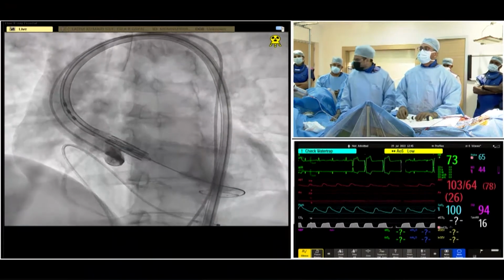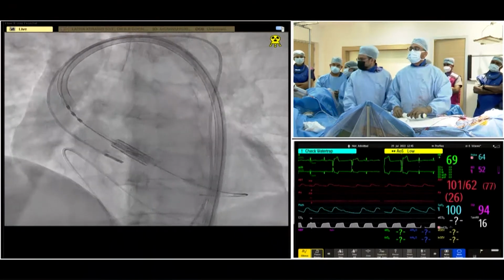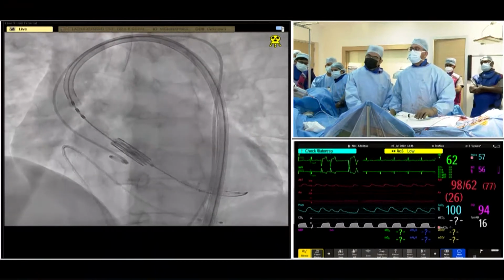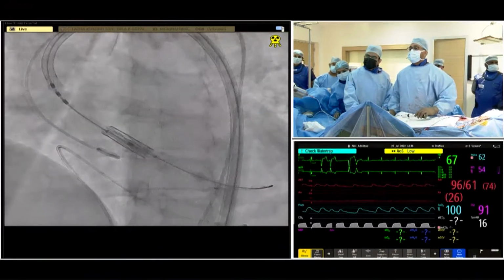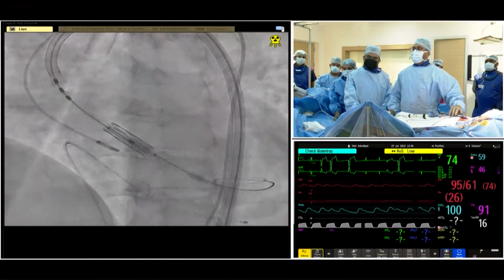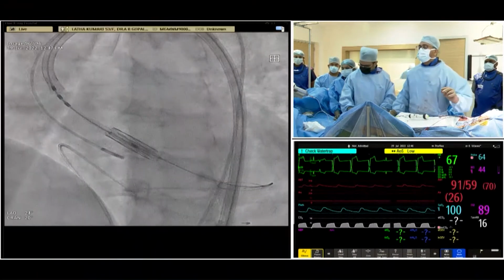Gopal, the earlier point that you had made about preserving future TAV in TAV options, I think that also makes balloon expandable a slightly better choice here. Although in 10 or 12 years from now, when this valve fails, we should hopefully still be a good surgical candidate. Yeah, so I have counseled the patient for a TAVR in TAVR and a TAVR in SAVR. But I'm not sure she'll take a SAVR, having not agreed to a SAVR the first time. But I think to shut me off, she said yes. Well, this valve will never fail.